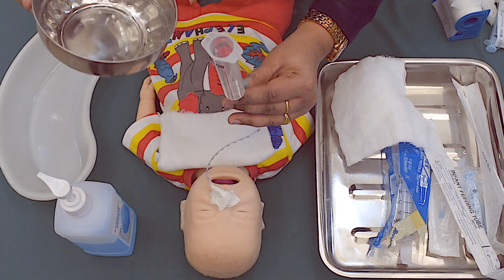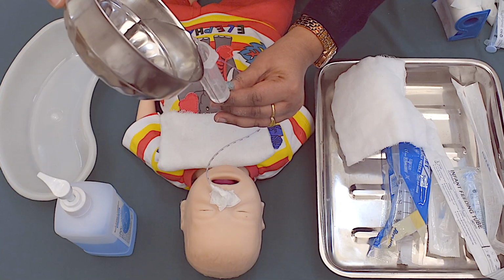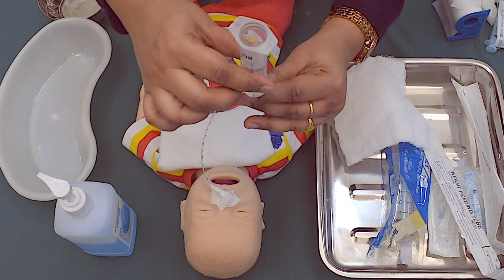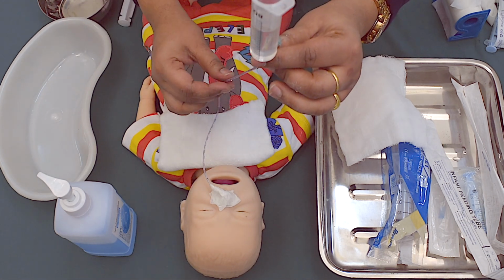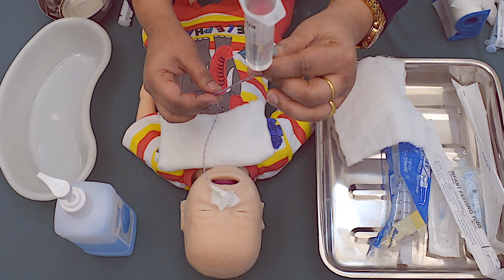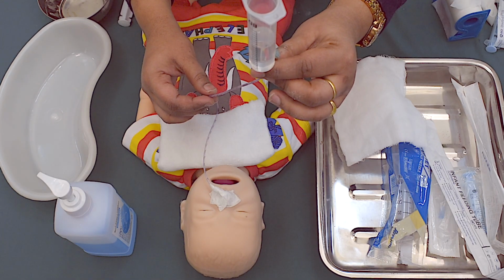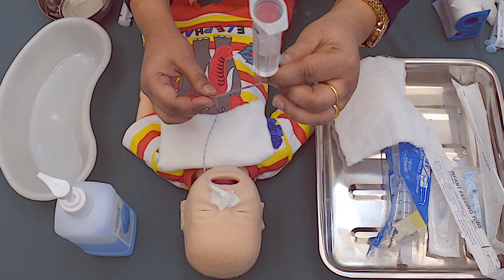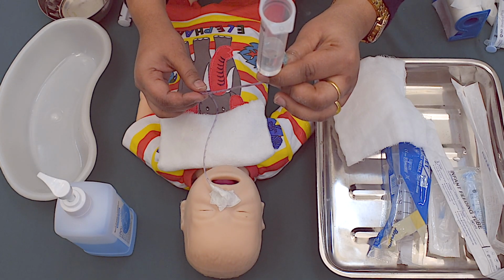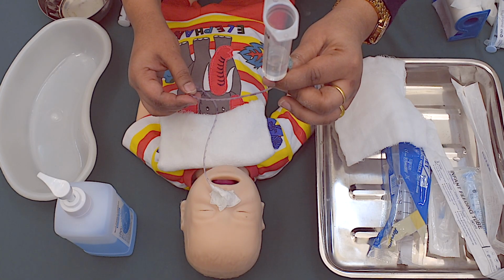Pour the required amount of feed, release the clamp and let the feed flow freely. Let the feed flow. Add additional amounts if needed.